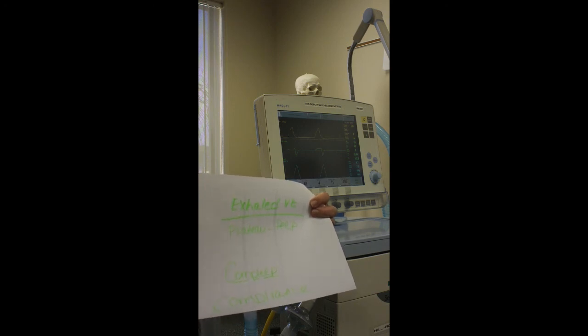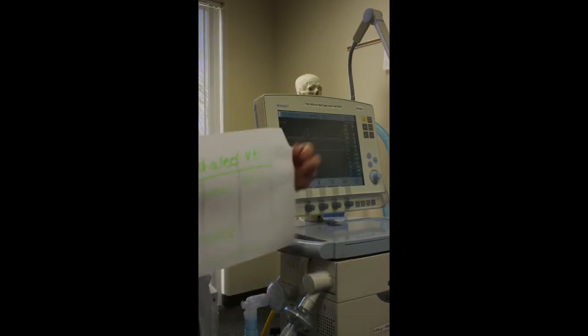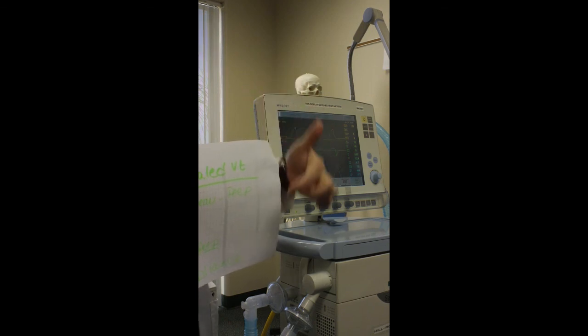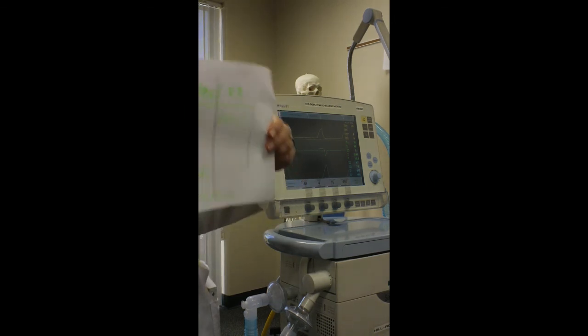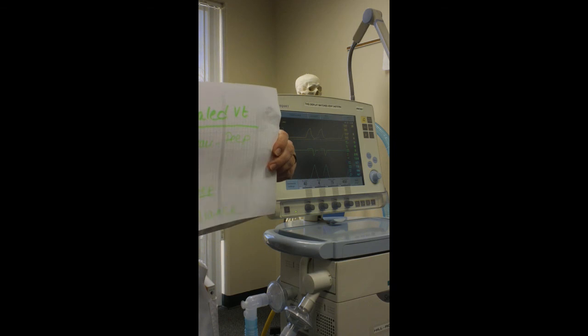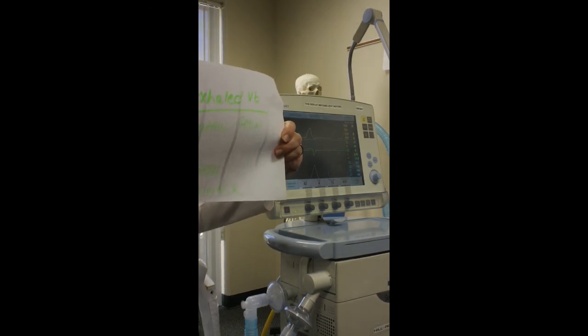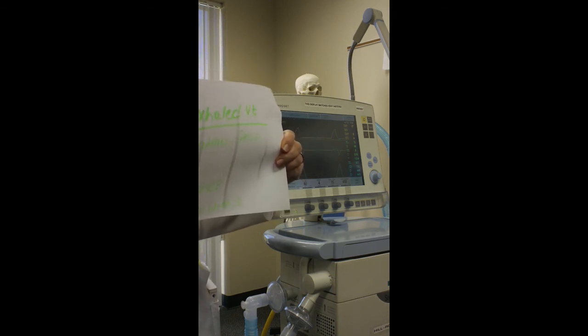Barotrauma. So then decreasing compliance. We went from the nice big happy balloon to the little tiny balloon, increasing pressures, right? So same thing, if we're in volume control, our patient's compliance goes down, you'll see your pressures go up. So changes in resistance and compliance are going to affect how you ventilate them. This is something you're not going to walk out of here and understand today, but by the time we're done to run a vent, you have to understand how compliance and resistance, number one, what diseases, as we're going to start talking about next week, have caused changes in compliance, and what are they? And how is that going to affect your ventilation of your patient?